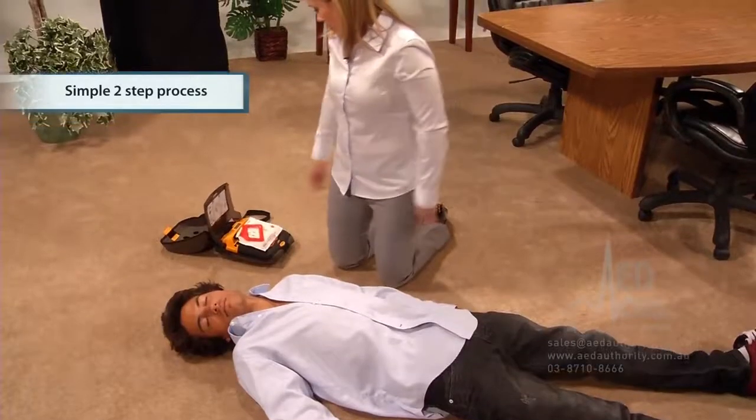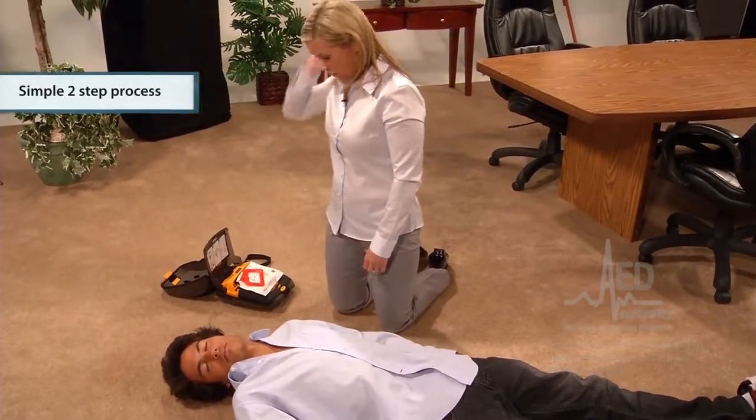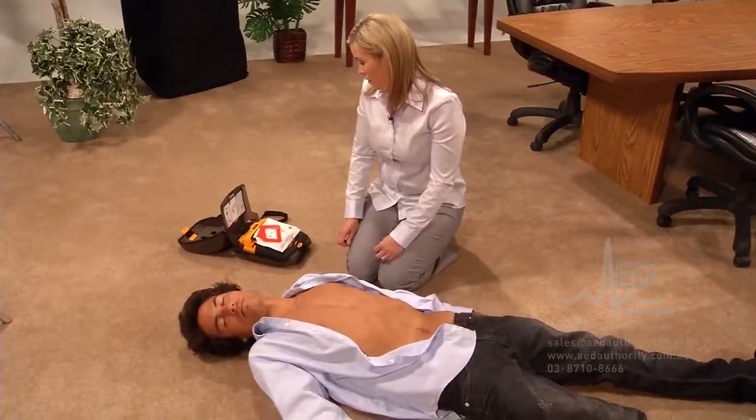Call for help now. Remove all clothing from the patient's chest. You have already called 911, so remove the clothing from the patient's chest as quickly as possible.